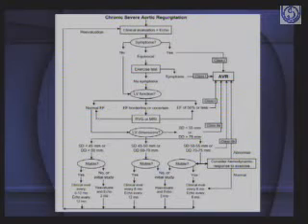So the top one here says clinical evaluation plus echo. Symptoms, no. Look at LV function. If the ejection fraction is normal, then you don't have to worry.